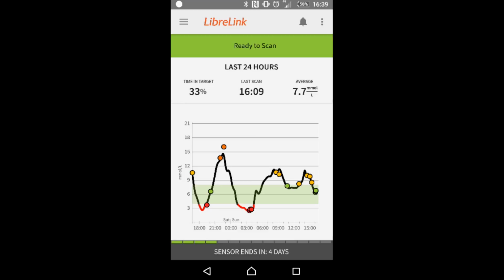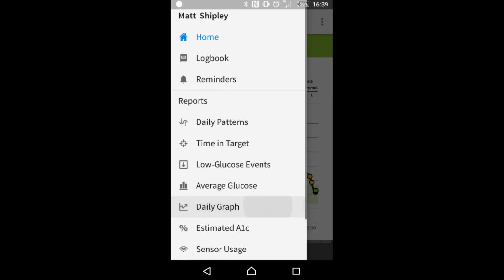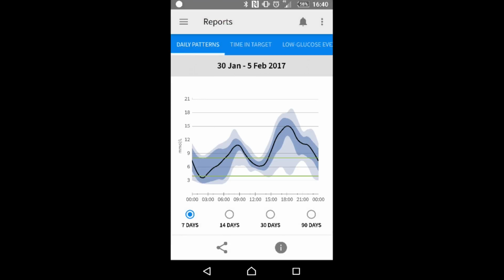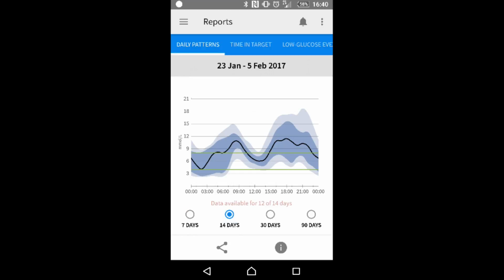Now I'll show you the menu. So if I tap on the menu at the top there, it's got all the bits and bobs here for your reports. There's a lot of data here, so you can see that it's got your daily patterns, time in target, low glucose events, average glucose, daily graph, your estimated HbA1c, and then your sensor usage. So I'll start off with the daily patterns, which, here we go, if I tap on the 14-day there, so I've had it for 14 days, it's a bit better.